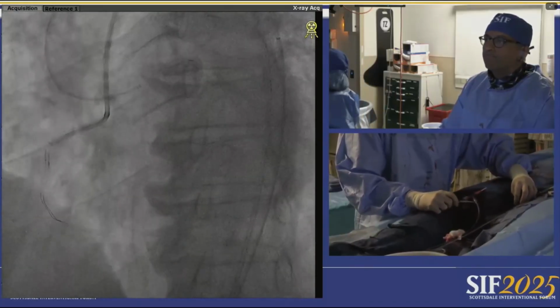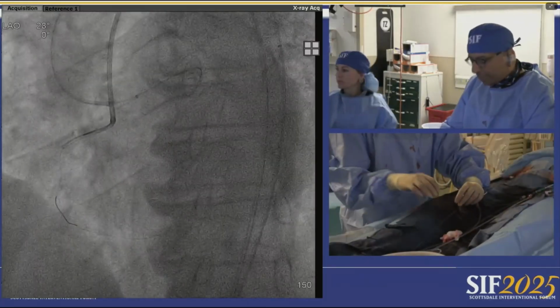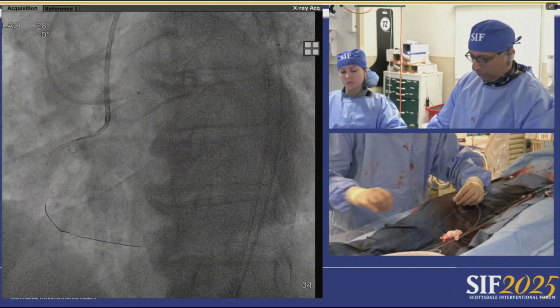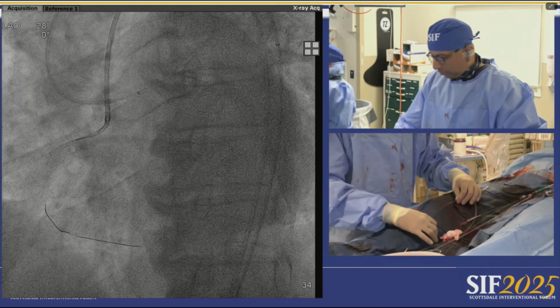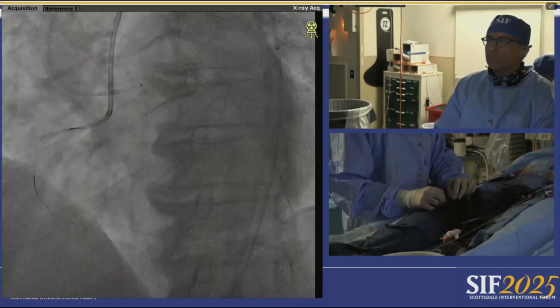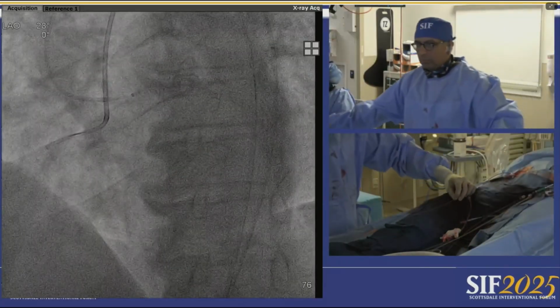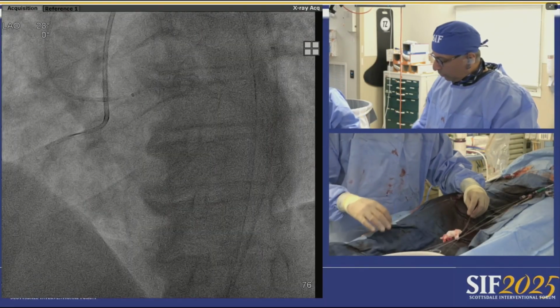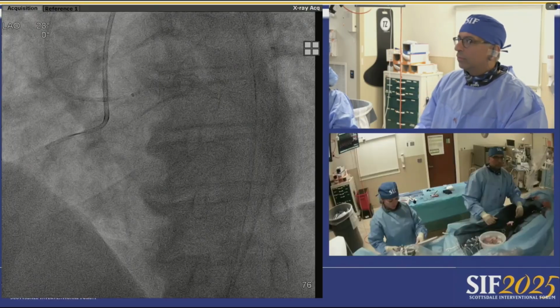I think one of the nice things about this case setting up is that it was really thought about, like, what's going to be my problem? Even if I cross this lesion, I have a ton of inflow disease that's calcified. Sometimes it's easy to get locked in about just crossing the lesion, putting the wire down, getting the microcatheter, and then you realize you have 60 millimeters of calcified lesion upstream, especially if you get subintimal and have to cross with an ADR, and then you have a bunch of upstream calcium. You're always struggling about rota up front, worrying about getting into the ADR planes. This was really super well thought out and just simplifies the actual crossing.